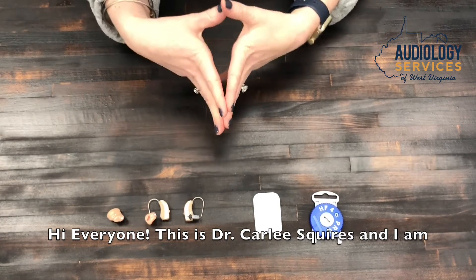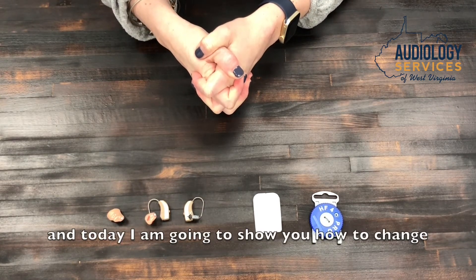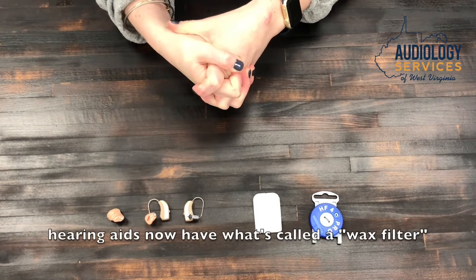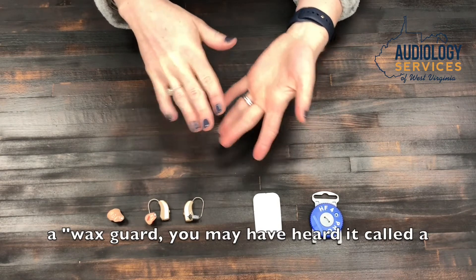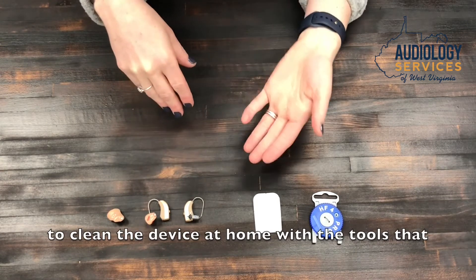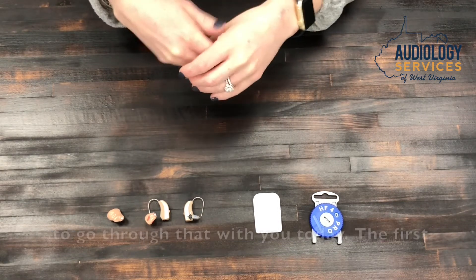Hi everyone, this is Dr. Carly Squires and I'm here with Audiology Services of West Virginia, and today I'm going to show you how to change the wax filter in your hearing aid. Most hearing aids now have what's called a wax filter, a wax guard — you may have heard it called a wax trap. Those are just ways that we can help to clean the device at home with the tools that are given by the manufacturer.